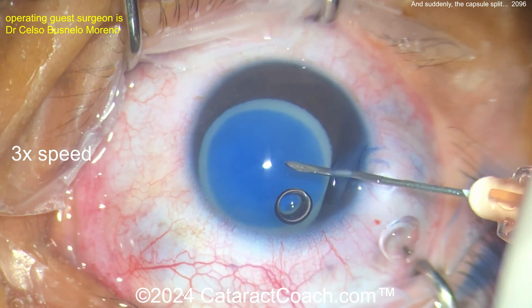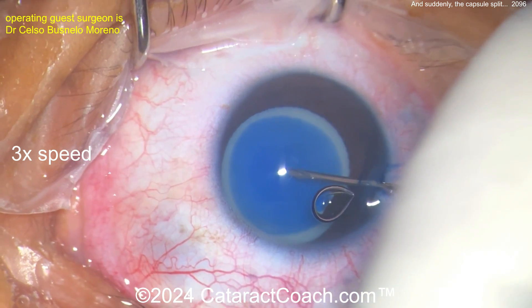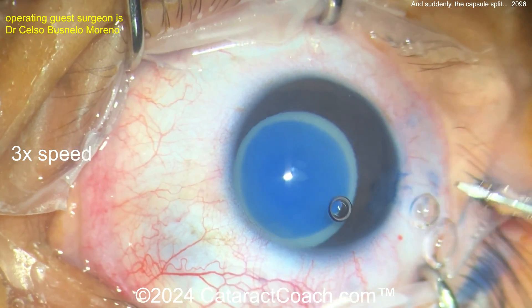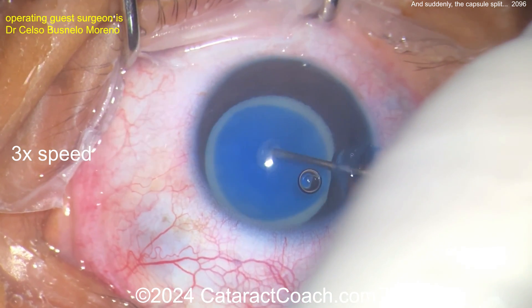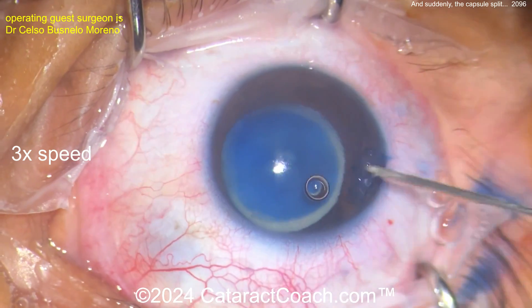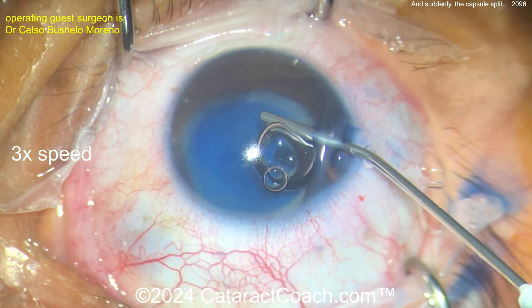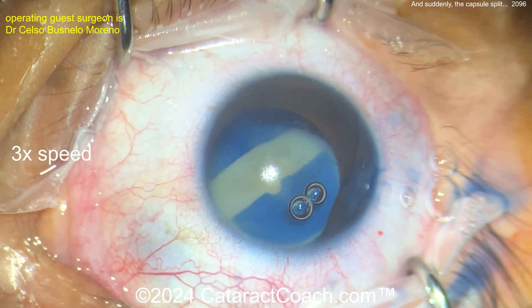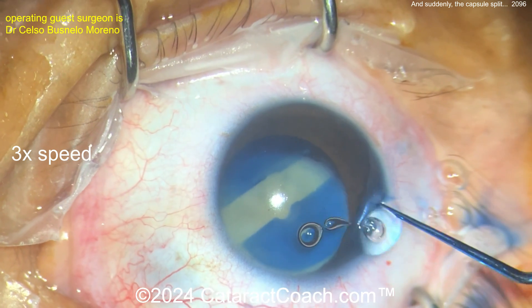I like to actually touch the blunt cannula to the capsule to see how pressurized it is. If the capsular bag is super pressurized, then even poking in with the needle for decompression can cause it to split out. So here we go — needle decompression. I like to go bevel down and then aspirate, but remember rocking the nucleus: aspirating just removes the anterior cortical liquefied material, not the stuff behind the nucleus. Viscoelastic going in, and pow — right open. Obviously very highly pressurized.